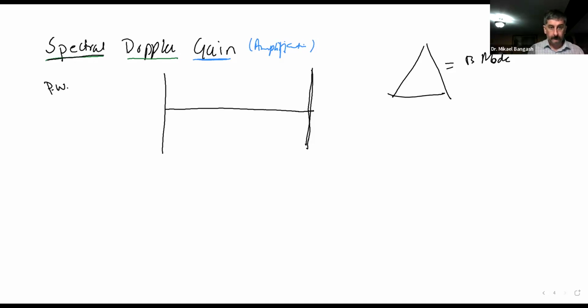But we may see the sample window, and of course, you have to make sure that it is placed inside the blood vessel.